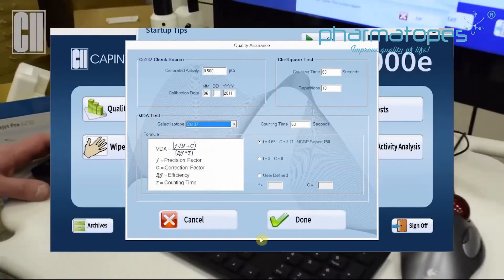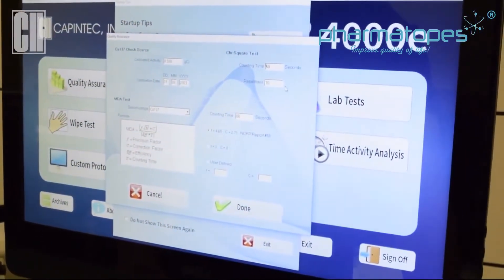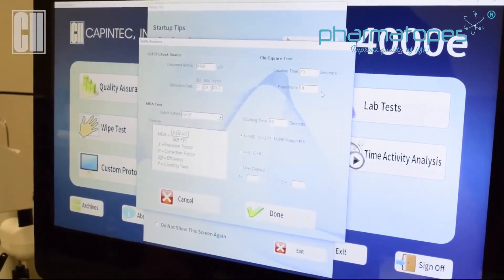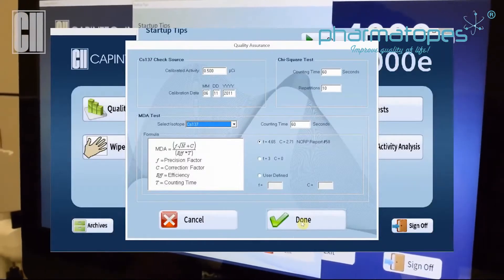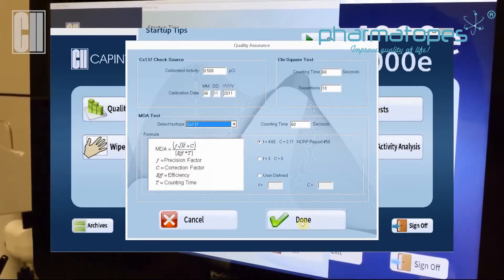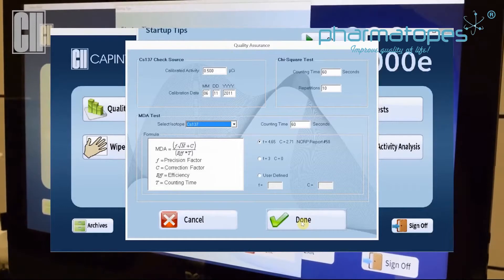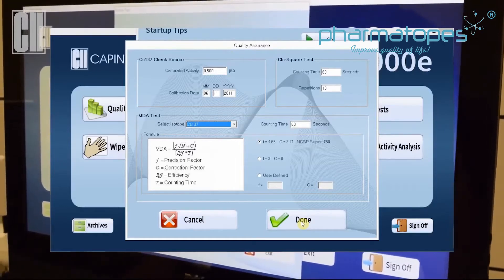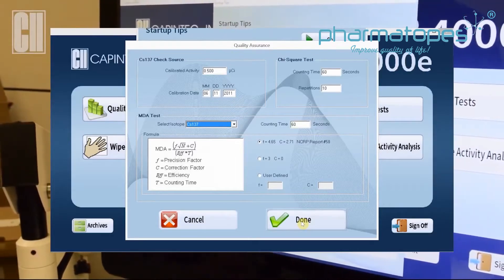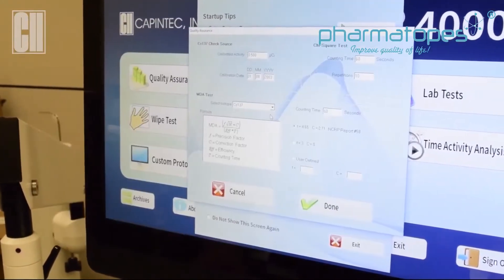Then you want to check your Chi-Square settings. Typically it's set at 60 seconds for 10 repetitions — that depends on the facility, but that would be the most common setting for the Chi-Square MDA test. The same thing would be decided by the facility: what isotope they would want to look for in their MDA test. The source must have an efficiency measure in order to select it for the MDA test.